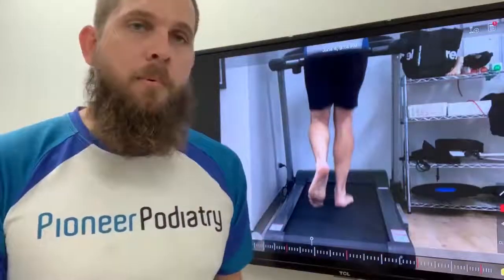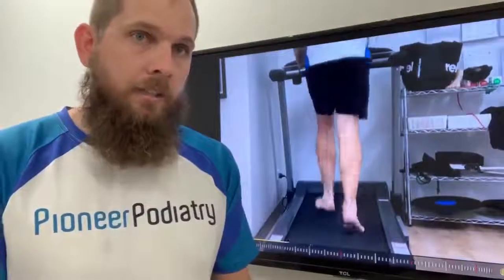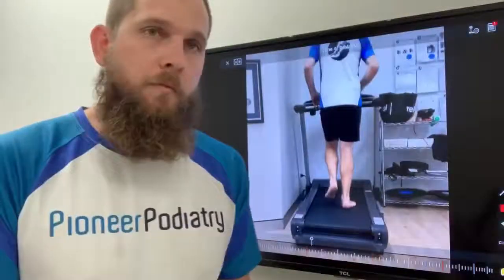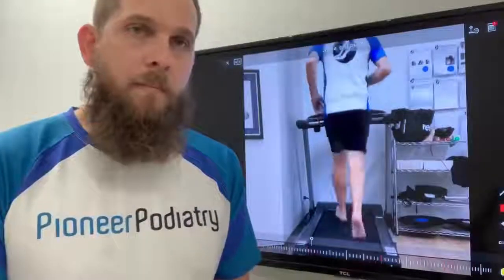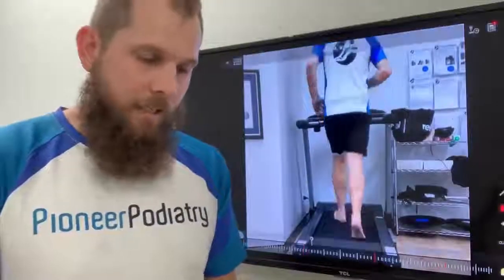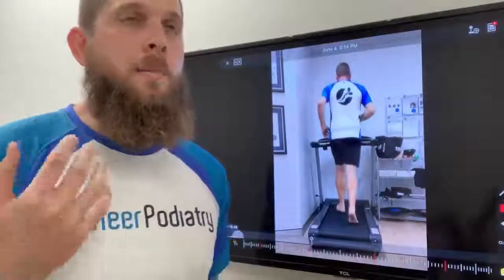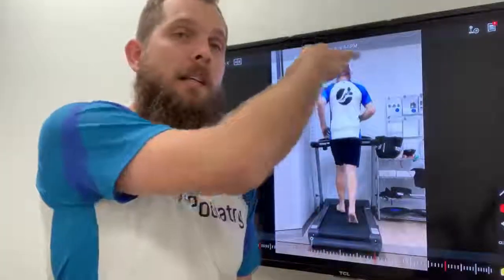This is an example of some video gait analysis that allows us to break apart the running gait. This is me running just before. Now, I'll just point out some things. It allows us to pause, go forwards, go backwards, and assess the whole body. As podiatrists, we're mostly interested in the foot and ankle, but we will be hearing about injuries in other areas further up the kinetic chain as well.